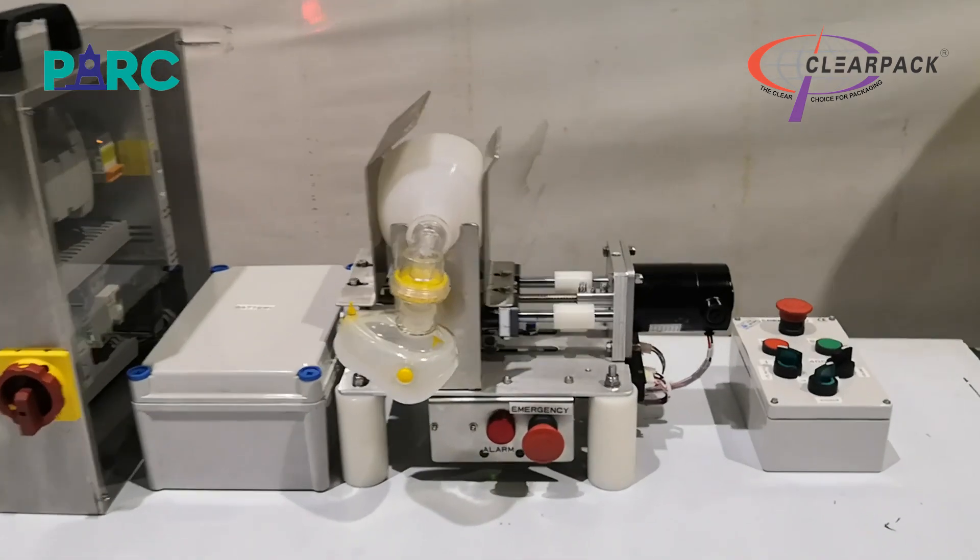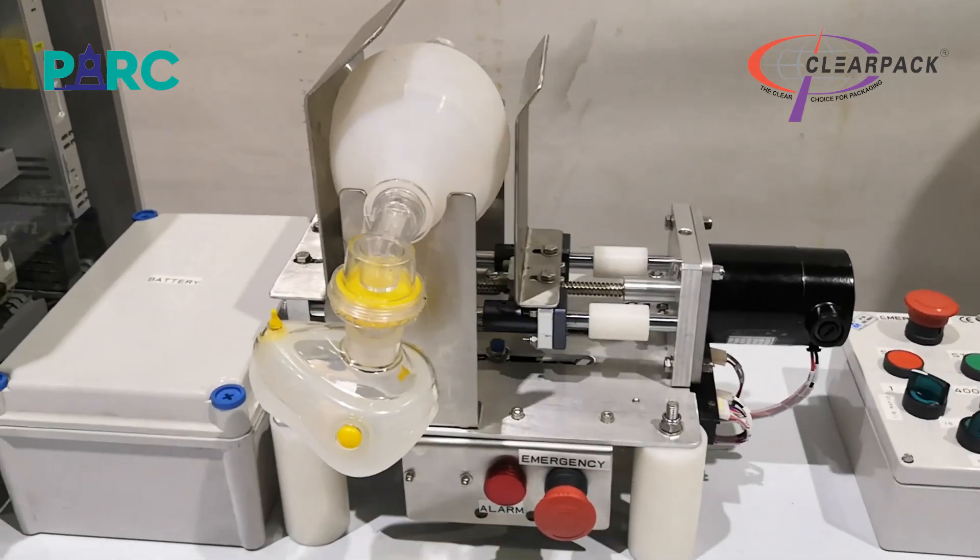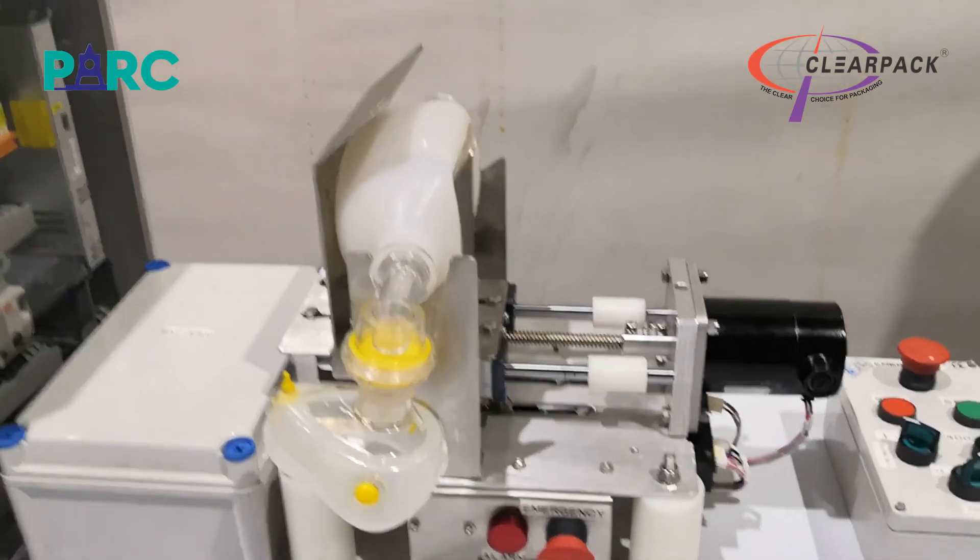The heart of the system is the Bag Valve Mask or Ambu Bag, which supplies a volume of air to the patient when it is pressed. This pressing action has been automated so that it is regular and reliable.